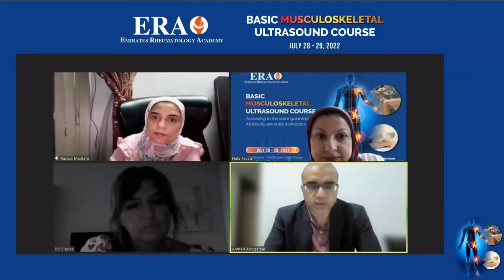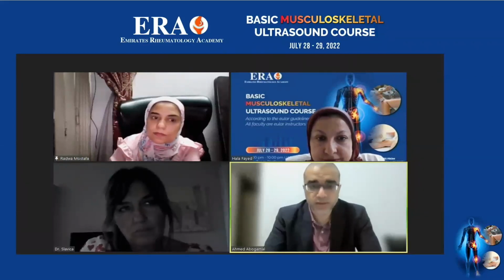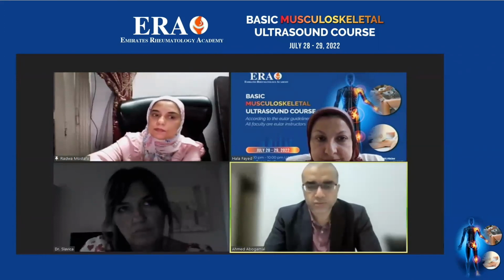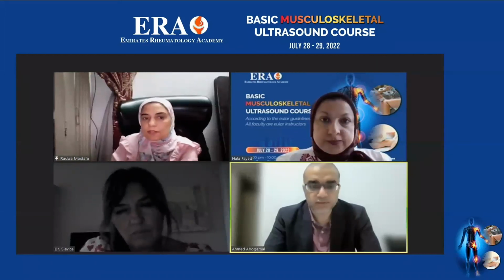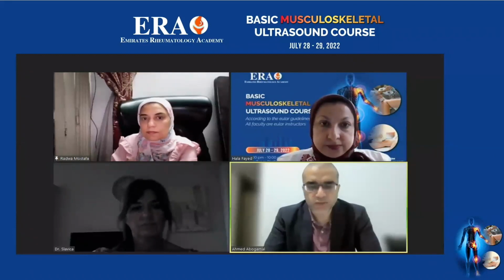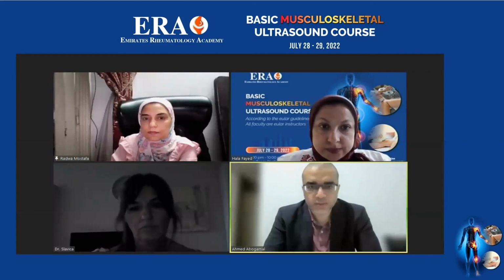It's better to always ask about the classification of acute enthesitis or chronic damage enthesitis. That is actually the most important part to answer. But to have a clear-cut differentiation between mechanical and inflammatory enthesitis, even with more efficient imaging modalities for the bone itself, like MRI, you still have queries. Also, you cannot clearly differentiate between the types, because they overlap in some patient scenarios.